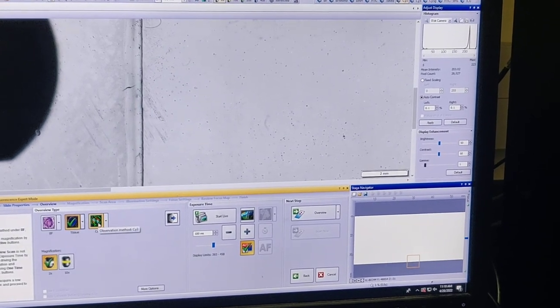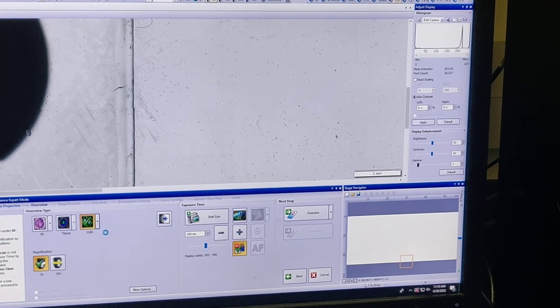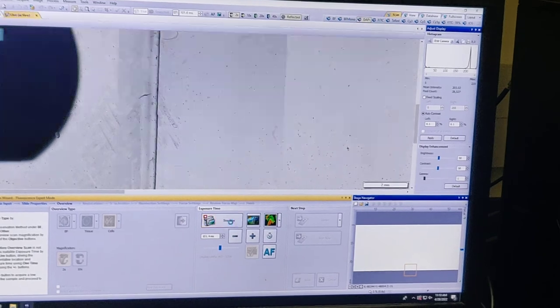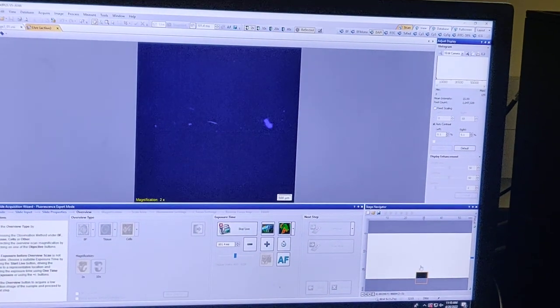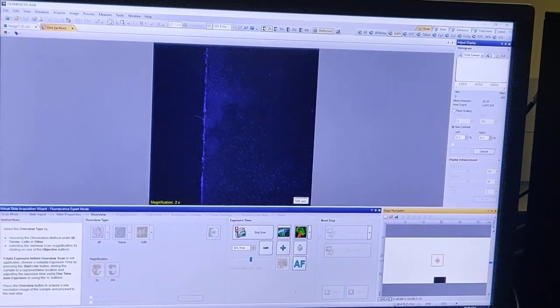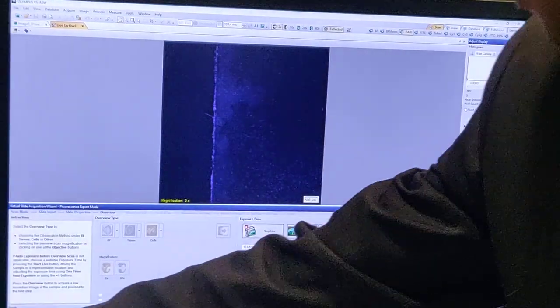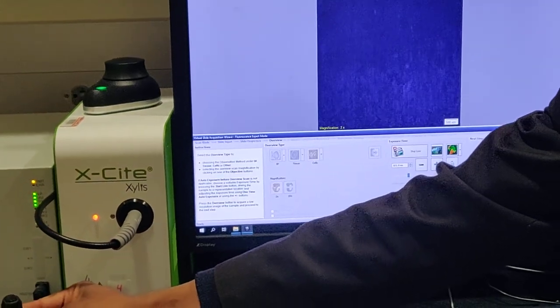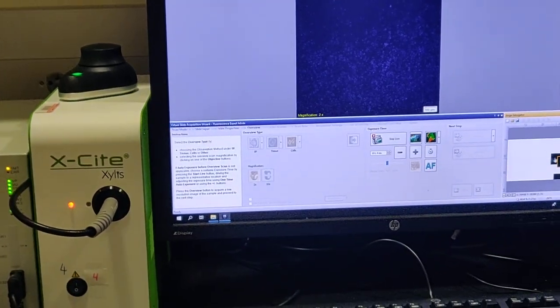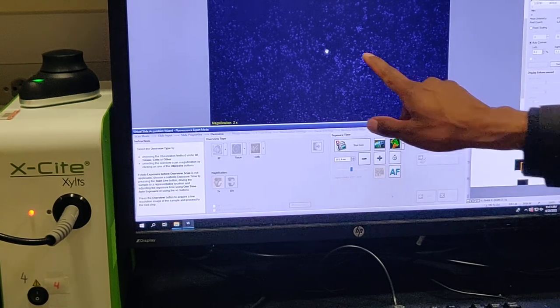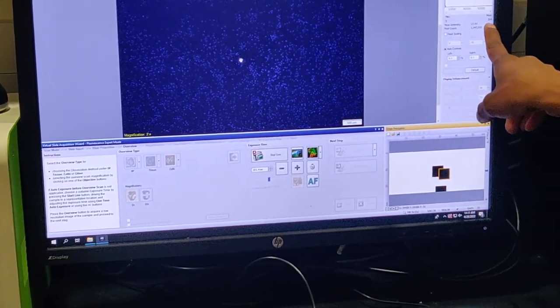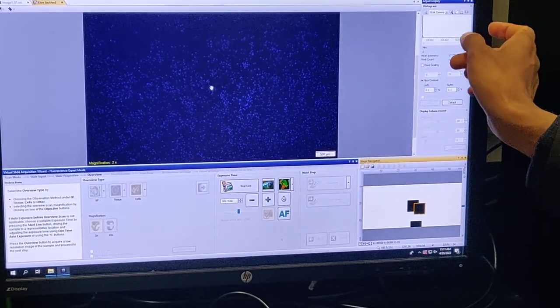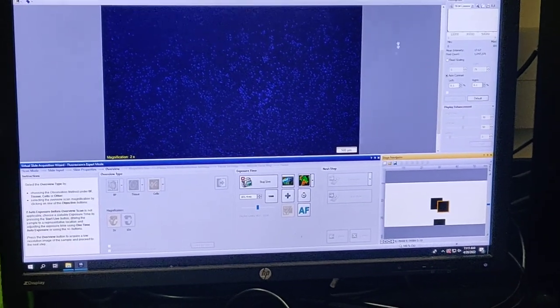In live view, imaging is somewhere at the bottom — I'll bring it to center. I can see the coverslip edge and tiny nuclei dots. The intensity is very low, around 180–200 units, which is very dim. Let me try another color — FITC at 100 millisecond exposure. It's a little better; I can see cell structure and the intensity is around 1000 units, but those 1000 units are coming from random bright spots — the cells look pretty noisy.